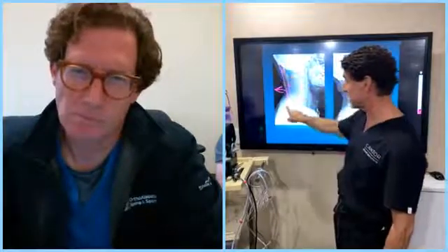So going back to what we were talking about before, our goal is we want to save that cable. In addition, there's certain areas that we need to be able to get access to. So in the center of the spine, when the cord is compressed, going from the back is very effective. But when the nerves are pinched off to the side, you sometimes have to go from the front. So every once in a while, we'll do a laminoplasty and combine it with a 1 or 2 level fusion in the front, versus a 6 level fusion, which will preserve everything that's still structurally important and still works, not cause any damage during the surgery, and preserve almost normal mobility versus compromising mobility.